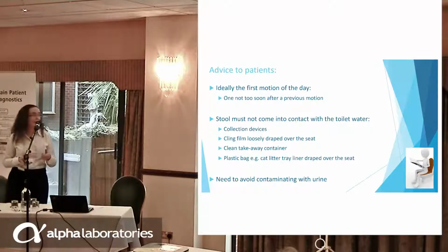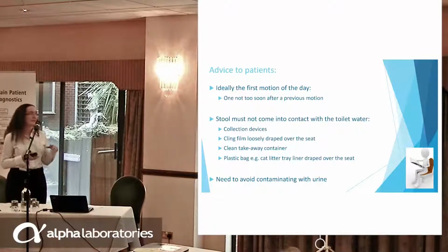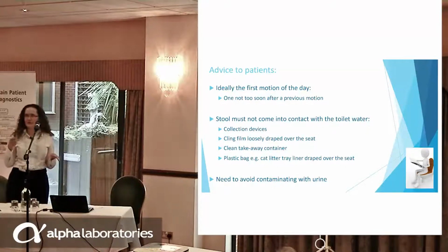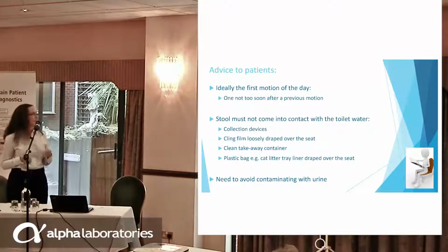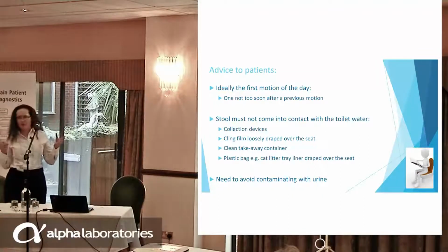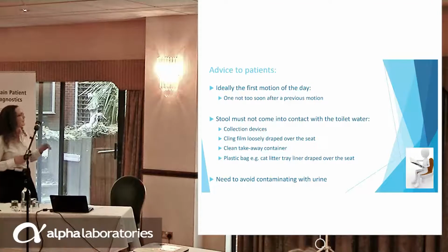The other rules that apply to your patients is obviously that the stool must not come into contact with the toilet water. Okay, that's going to contain bleaches and disinfectants, and it will impact your test. There are any number of ways that patients, quite ingenious really, can collect the samples. There are lots of collection devices available to help people if they want to. I think someone mentioned earlier the fecal collection devices and the papers that are handed out with the bowel screening things. Possibly not so appropriate in your IBD patients because they're not robust enough, more asymptomatic than symptomatic, you see what I mean?